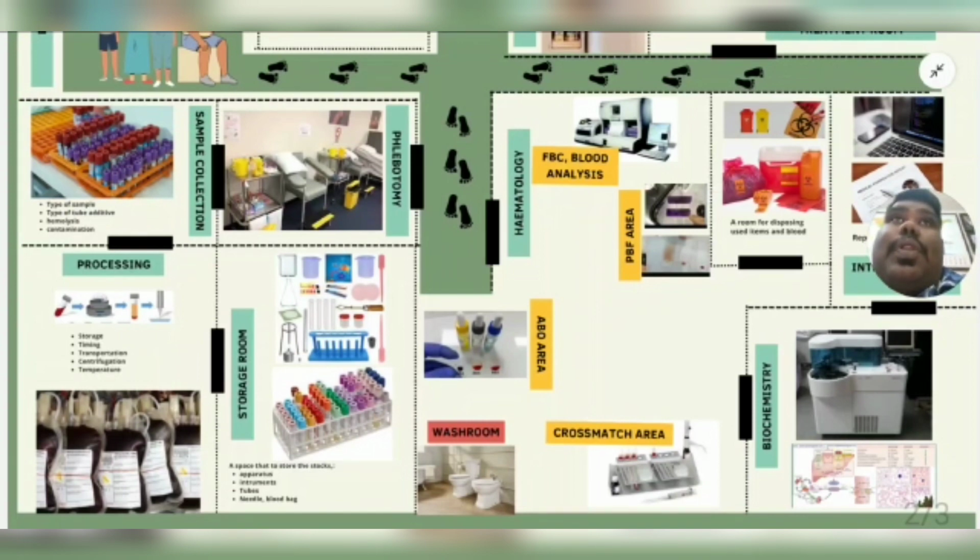And besides that, there must be a proper water flow for the machine. During extraction the machine will be using some amount of water, so for that we need proper distilled water and a proper water flow without any blockage. And every morning that machine must be calibrated and the quality control must be recorded as well, to avoid any incorrect or false result.